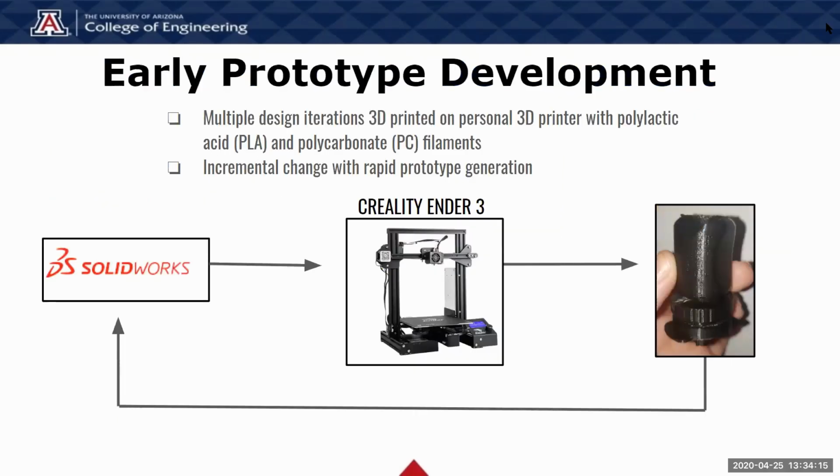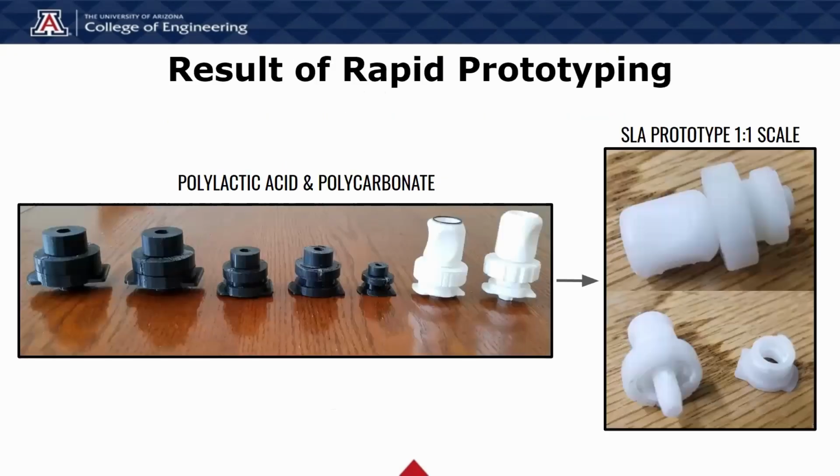For the early prototype design, we had multiple design iterations 3D printed on a personal 3D printer with PLA and polycarbonate filament, and we incrementally changed the design through rapid prototype generation to produce the best result. The next is a result of rapid prototyping. We prototyped it with PLA and polycarbonate.